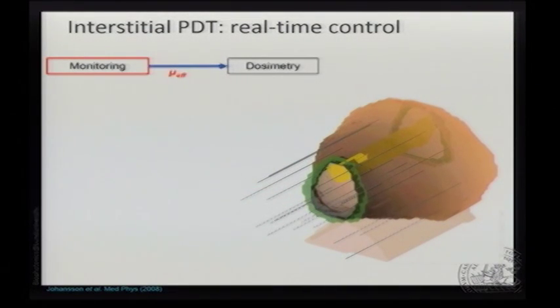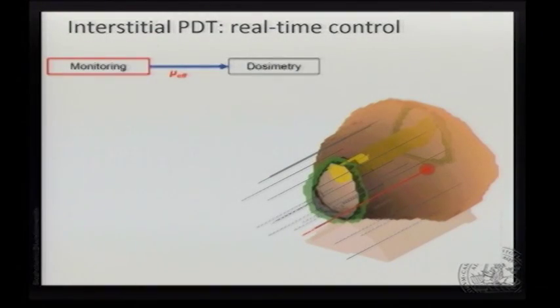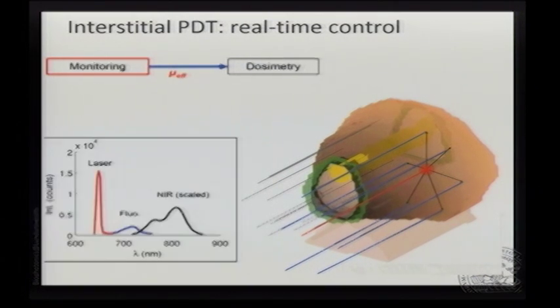Then you do some treatment planning. You measure again where the fibers are with ultrasound, and now you have to recalculate exactly how you should treat optimally. But in the original treatment planning, you just use optical properties that you assumed were common for any prostate. Now we actually have so many fibers in here that we can assess these properties by doing some measurements. We send light in one fiber only to start with, and measure with a number of the other fibers how much light we have.